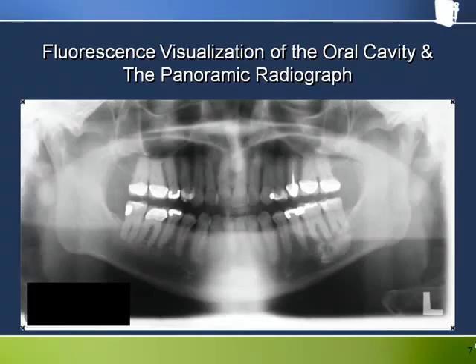Similar to radiographic interpretation and imaging, VELscope utilization requires an understanding of underlying principles, a sound background in anatomy and physiology, and an appreciation of normal variance. This understanding is a key to taking full advantage of the technology and using it to discover abnormalities that truly warrant further investigation.